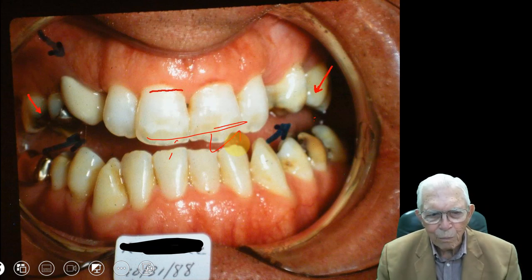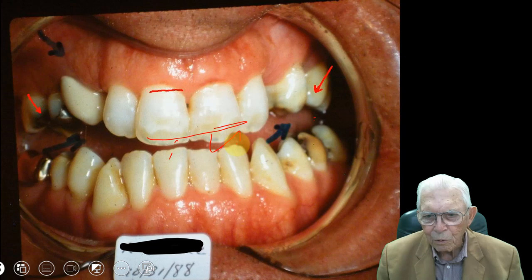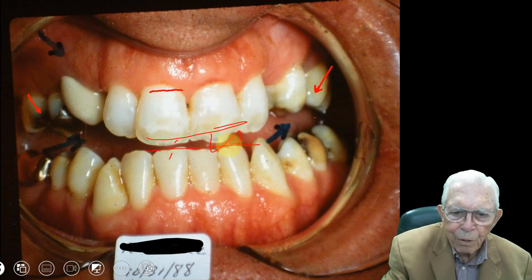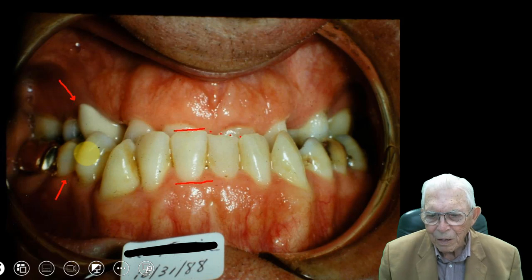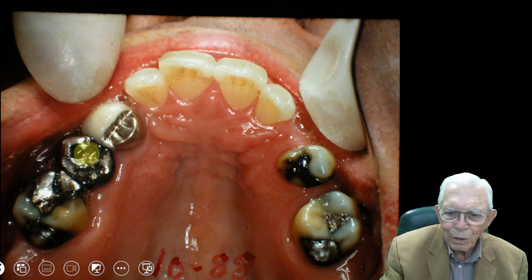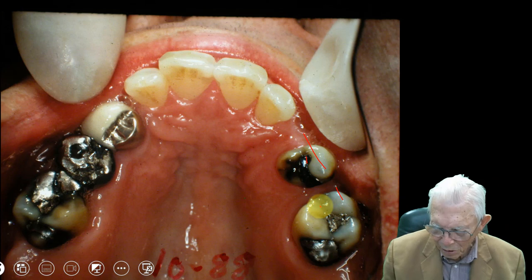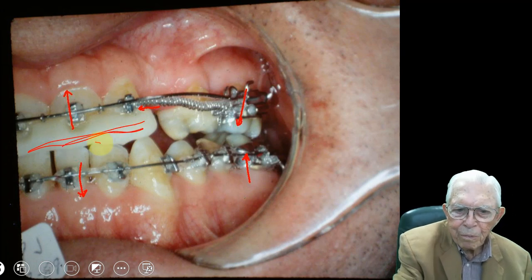You can put these teeth where they ought to be, and then you have gaps where he's missing teeth that you can fill in with regular orthodontics. We're going to put a pad up here and get these teeth together. I'm going to expand the upper arch while we've got it spread out like that. Here's the bottom arch down here and this is the upper arch — you can see how much smaller it is, and he's missing a bunch of teeth in here.